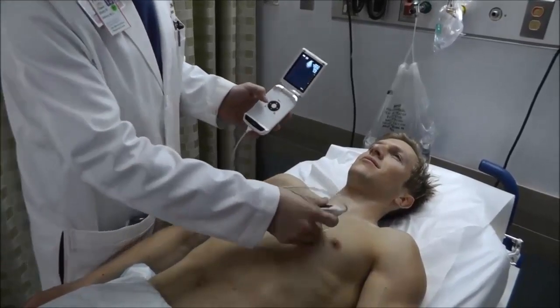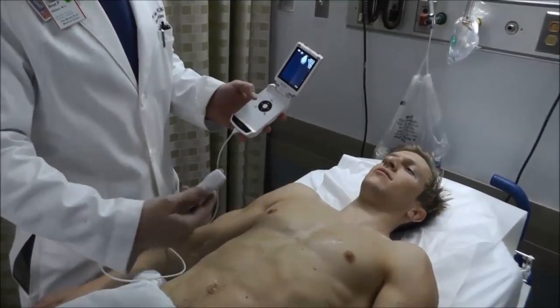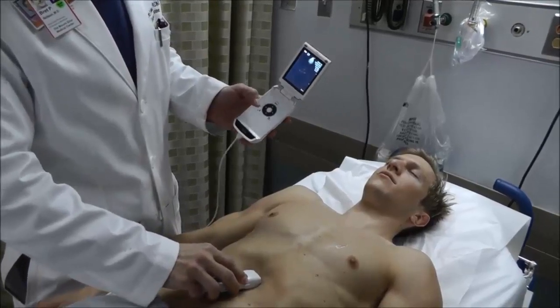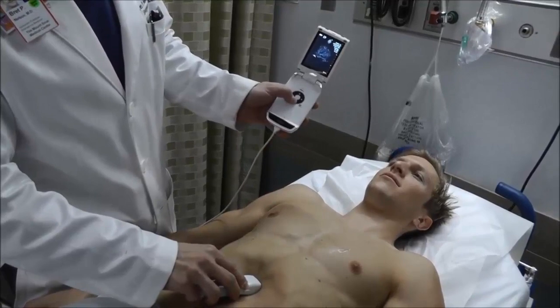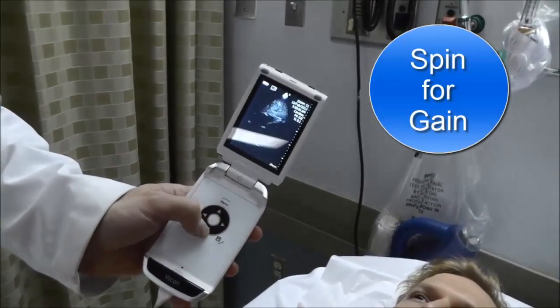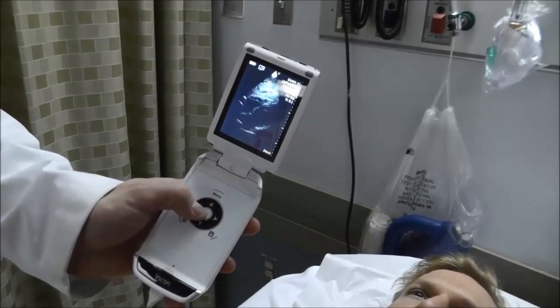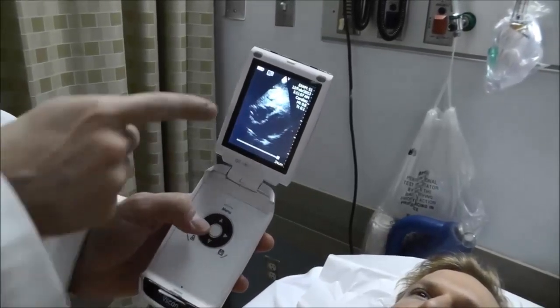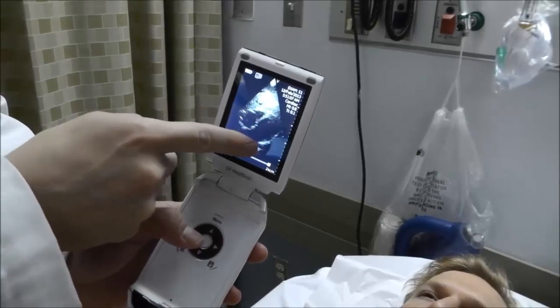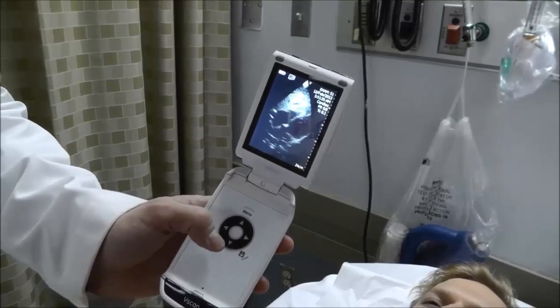We're still in cardiac mode. The next view can be done in either cardiac mode or abdomen mode. In cardiac mode, I'm going to have the probe marker facing towards the patient's left-hand side, and I'm going to perform a sub-xiphoid view — placing the probe below the xiphoid process, aiming up towards his left shoulder. I'll change the depth and brighten the image. We can see the liver in the near field, and beneath that the right ventricle, right atrium, left ventricle, left atrium, and the bright white pericardium around the heart in both directions.